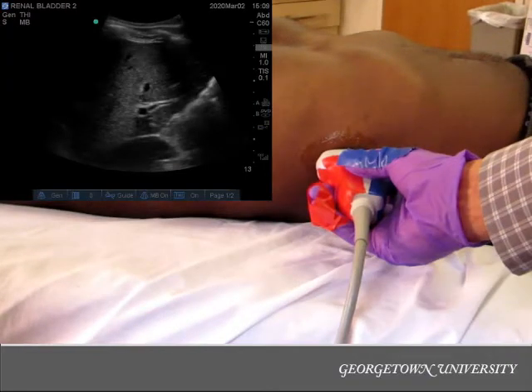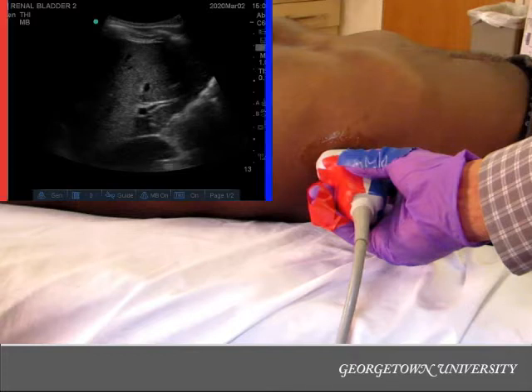The image shown is using the radiology convention, which means the probe marker is on the left of the screen and I'm holding the probe with the marker towards the head. Both the probe and the screen on that side are labeled in red here for clarity.